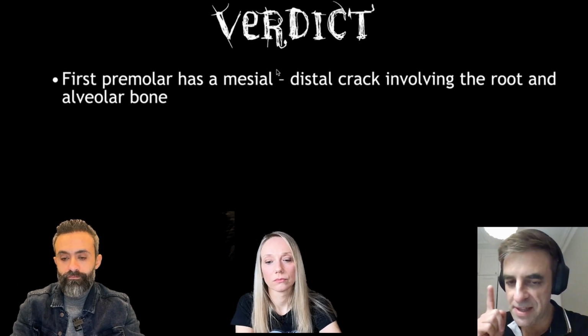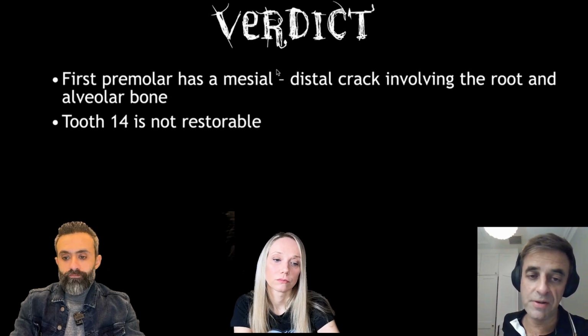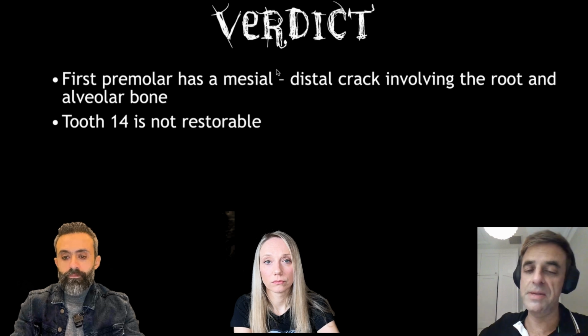Probably, I never say 100%, because you never know the situation of the patient. Maybe the patient has a poor prognosis themselves and just wants to get this tooth treated, and then not worry about the periodontal problems that are going to occur. But it's highly likely with a tooth like this, it's not restorable. But an opinion on this is really important, because the patients may decide in some cases not to get the tooth removed and maybe just leave it, but they need to know all the details. So you can really show them on the CBCT as well. That's what's happening with your tooth, and you can see this.